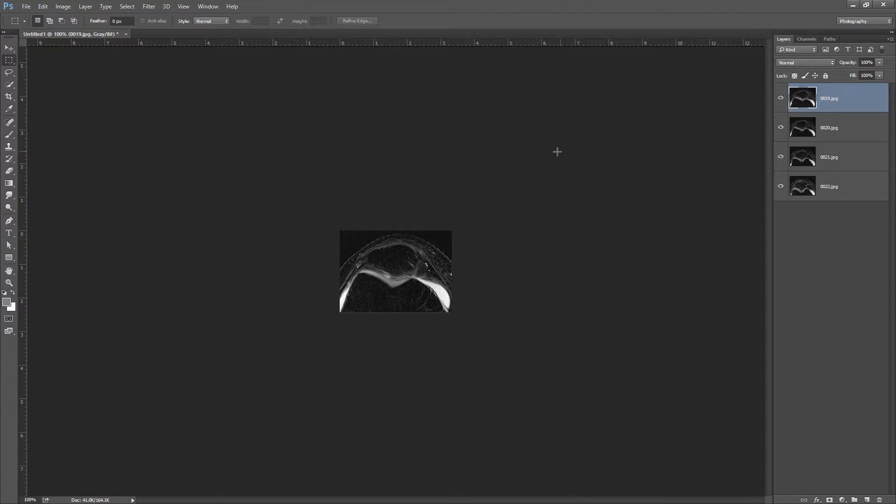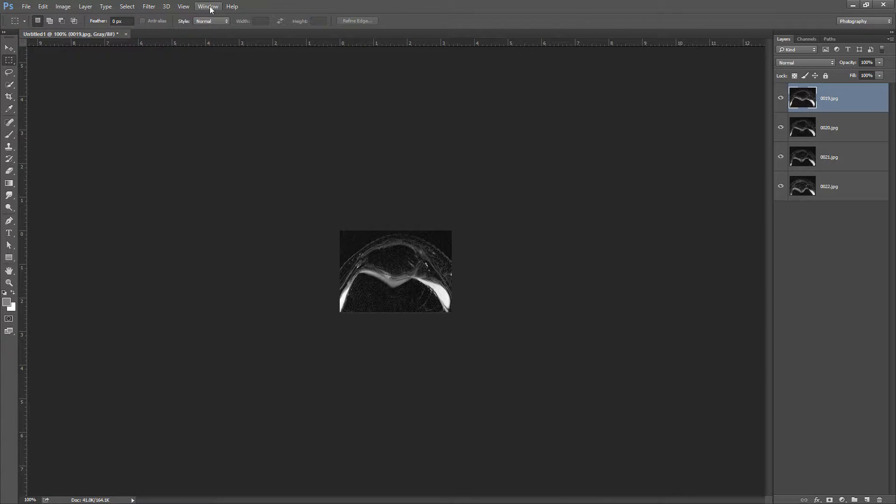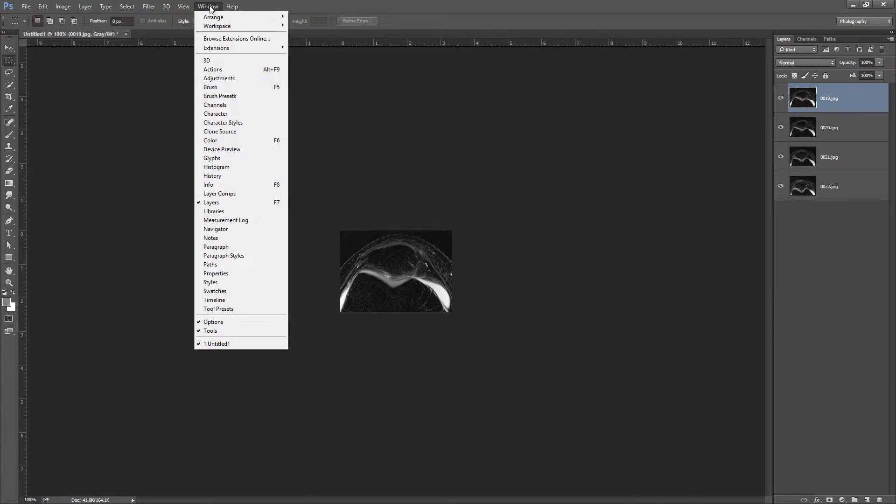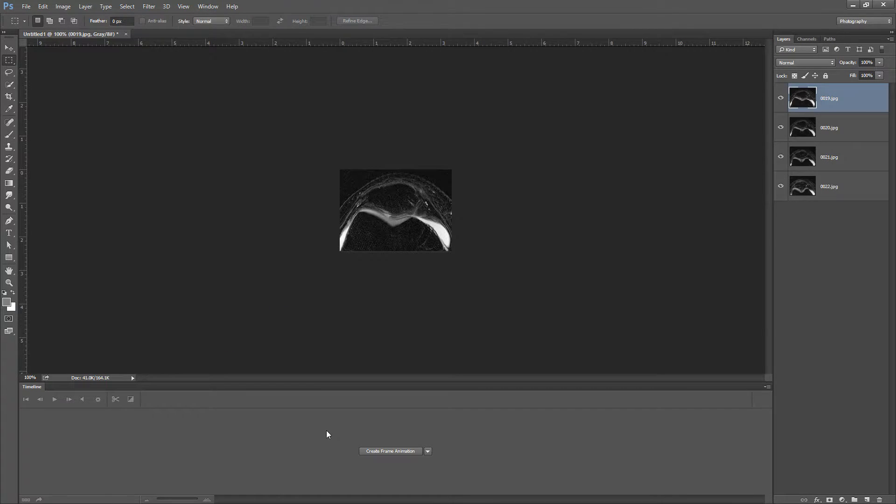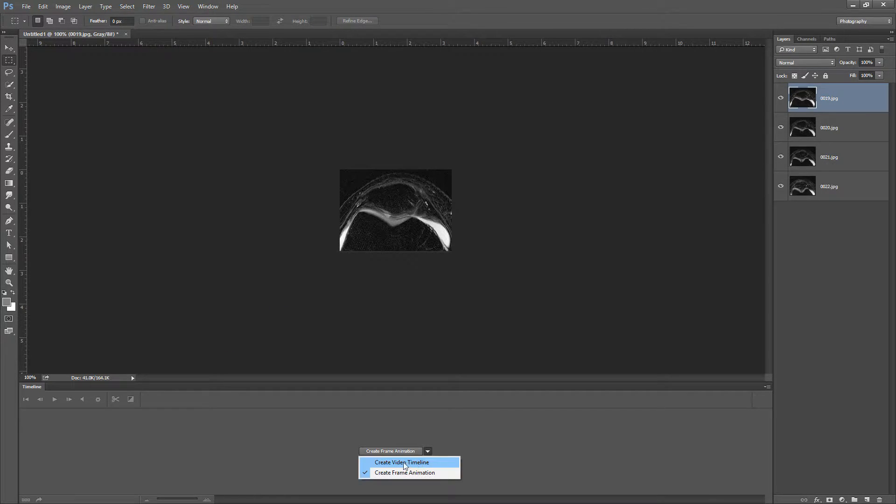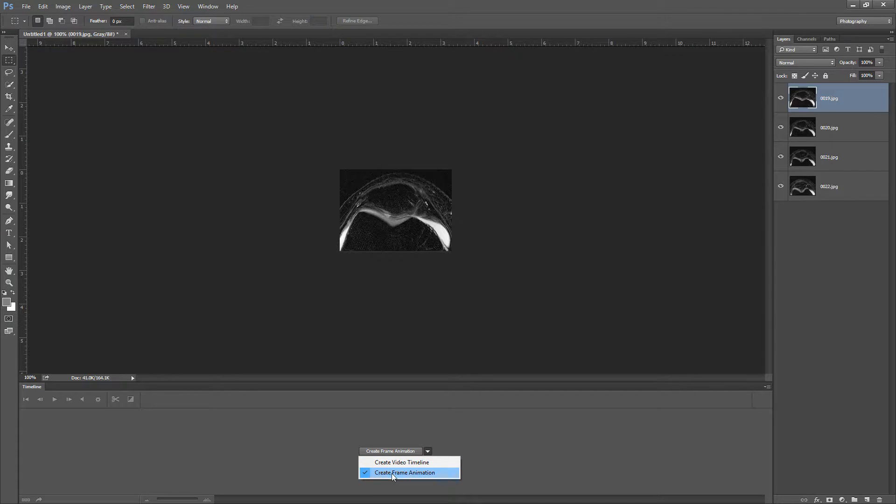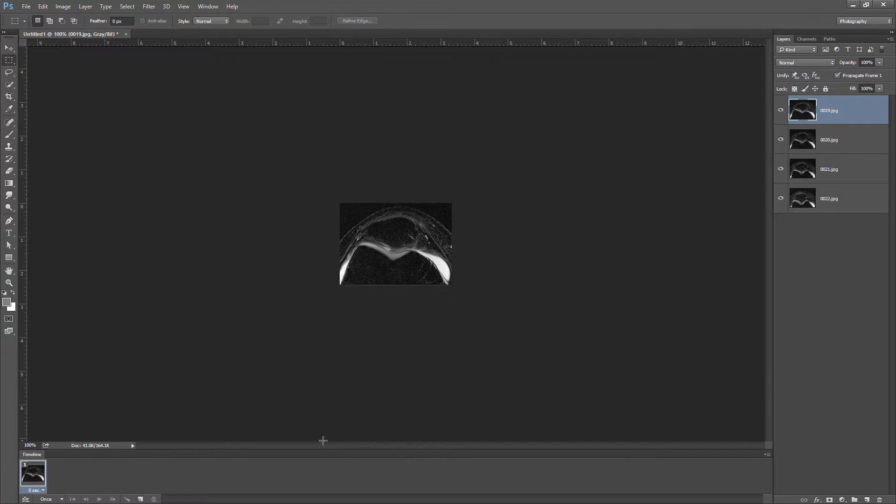Now I need to make these layers into frames in an animation. So I'm going to go to Window, Timeline. I need to bring up my timeline and it has two options here. I think it's defaulted to video, but I do frames a lot. So I'm going to go to Create Frame Animation and then click the button and it'll load up the initial frame here.